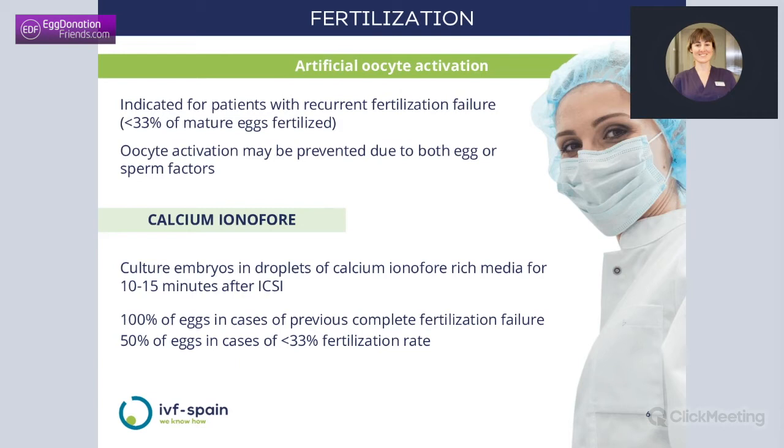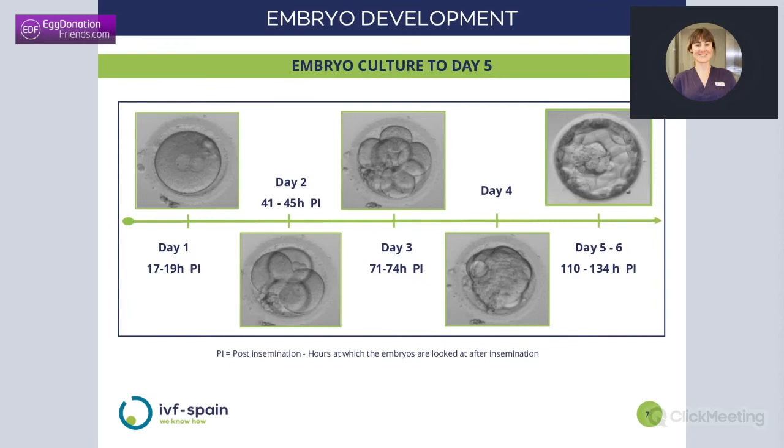Of course, you don't want to randomly use this technique if it's not necessary. What we sometimes do is apply this media to all of the eggs if the patient has had cases of complete fertilization failure. And if it's just a low fertilization rate, we consider applying it only to half of the eggs to see if this is really helping the case.